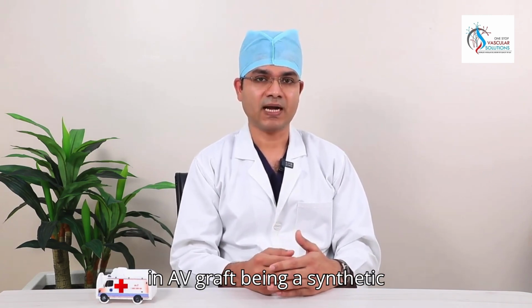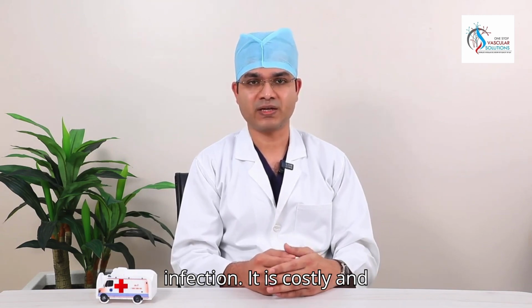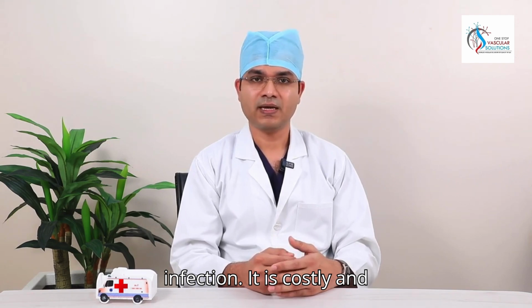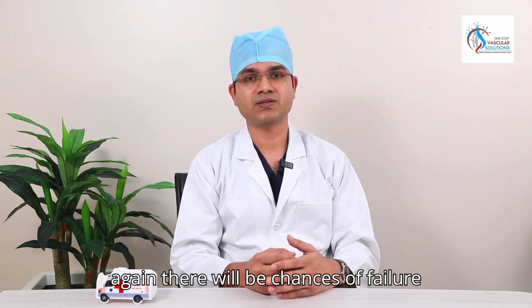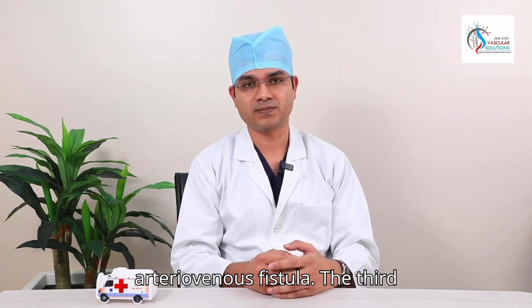Again, in AV graft, being a synthetic material, there are high chances of infection, it is costly, and there will be higher chances of failure when compared to an arteriovenous fistula.